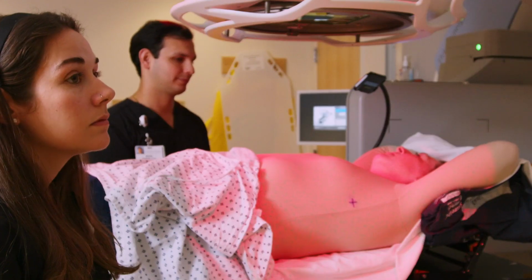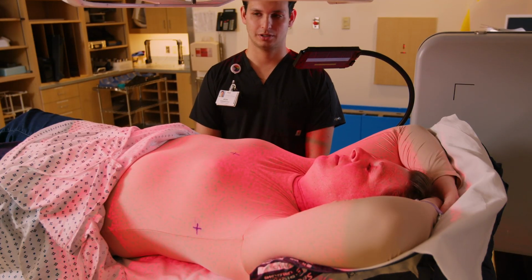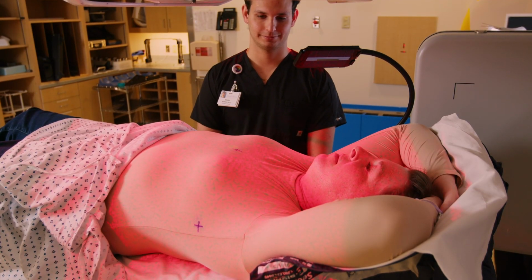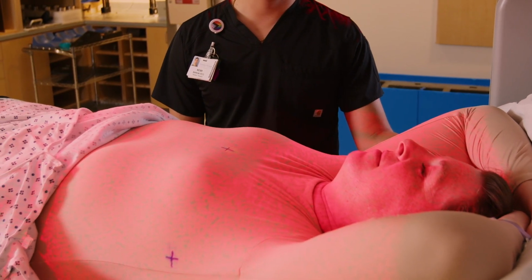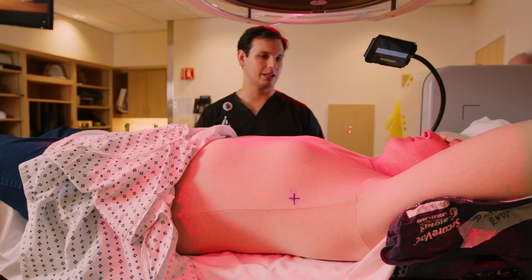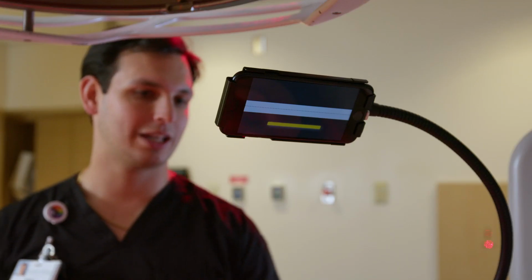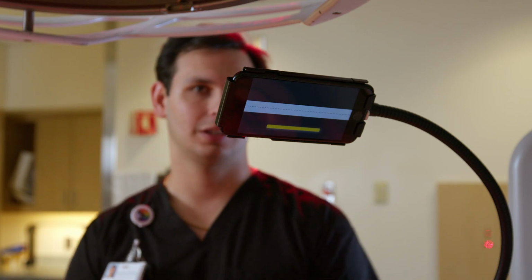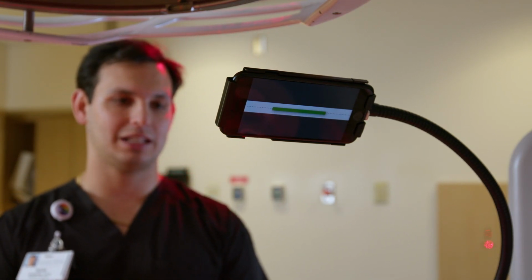Once you're properly aligned, the therapist will coach you into your breath hold. You'll be asked to take a deep breath in through your nose and hold. While you're holding your breath, the therapist may adjust the table to fine-tune your position. A small monitor will be moved into your field of view. It displays 2 bars, one thin and one thicker of varying colors. Your breath is represented by the thin colored bar.